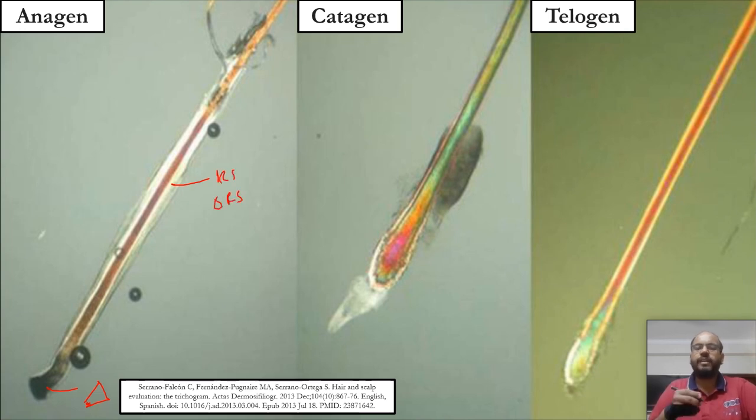Okay, and it's a straight shaft, but only the hair bulb is bent, which shows the hockey-shaped configuration because of forcefully plucking the hair bulb, which is firmly attached to the dermis.